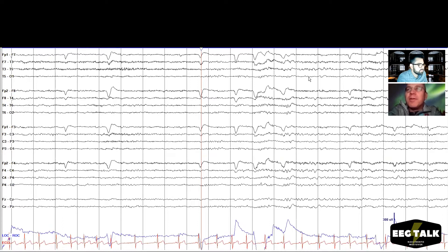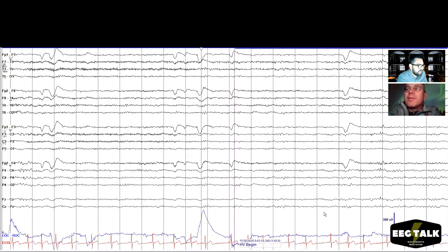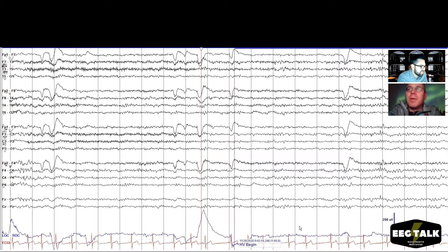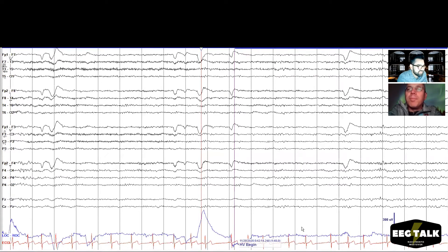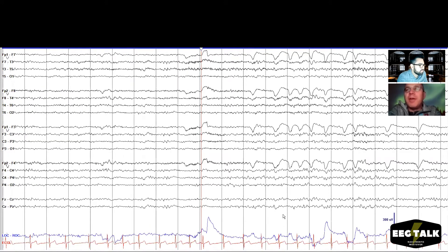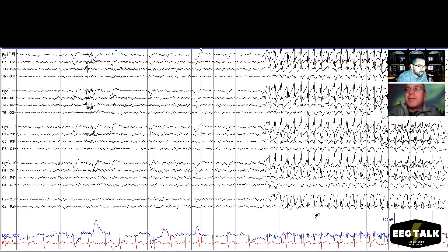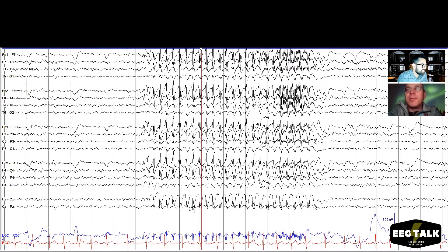There's a little muscle activity up front. I hope our technologist does some hyperventilation and some photic stimulation, because if it is absence — oh, there you go, HV. Hyperventilation begins. They're having this kid blowing a pinwheel, I'll bet. And it typically triggers absence seizures. I sometimes have my patients hyperventilate right in clinic. Whoa, what is that? What do we have here? That's not normal.